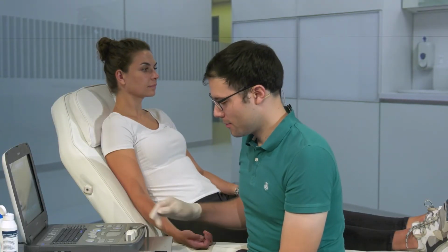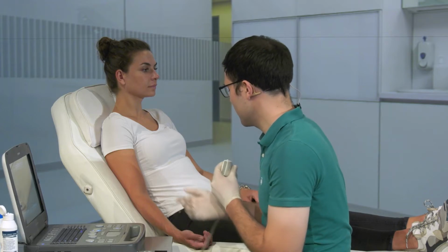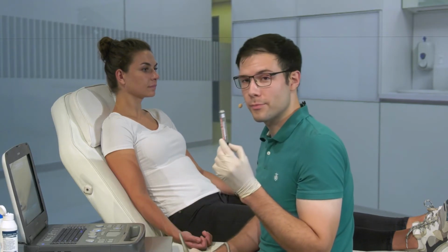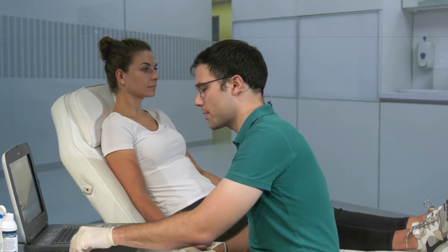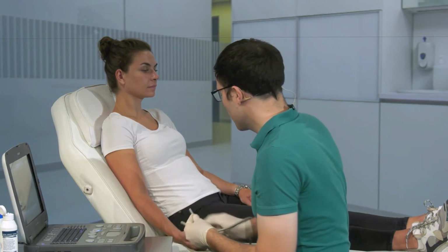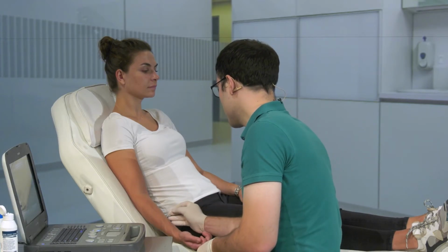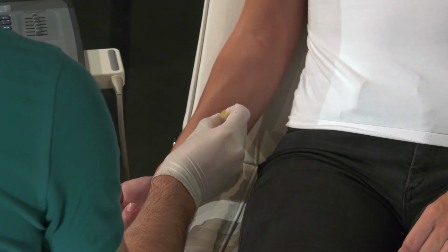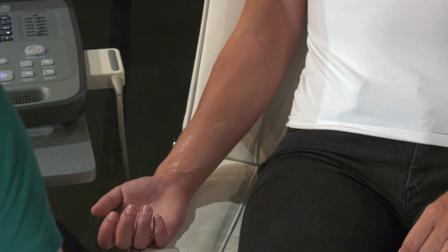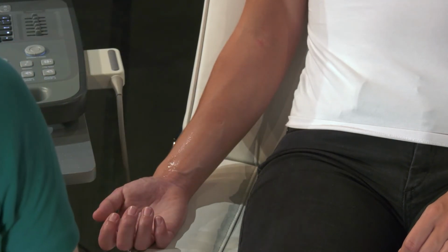After identifying the target muscle and the best route of access, you can mark the point of injection by using a marker or by using, for example, the tip of a needle cap. This last technique has the advantage that you leave an indentation in the skin that also will remain after disinfecting this area.